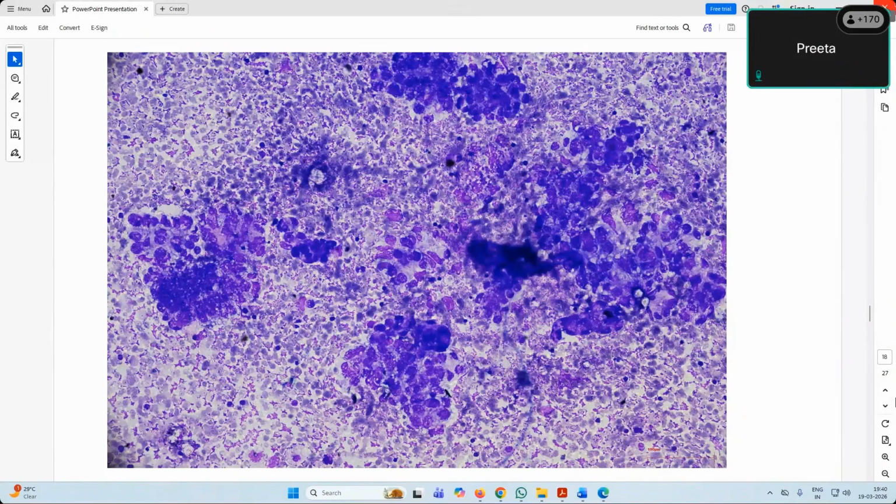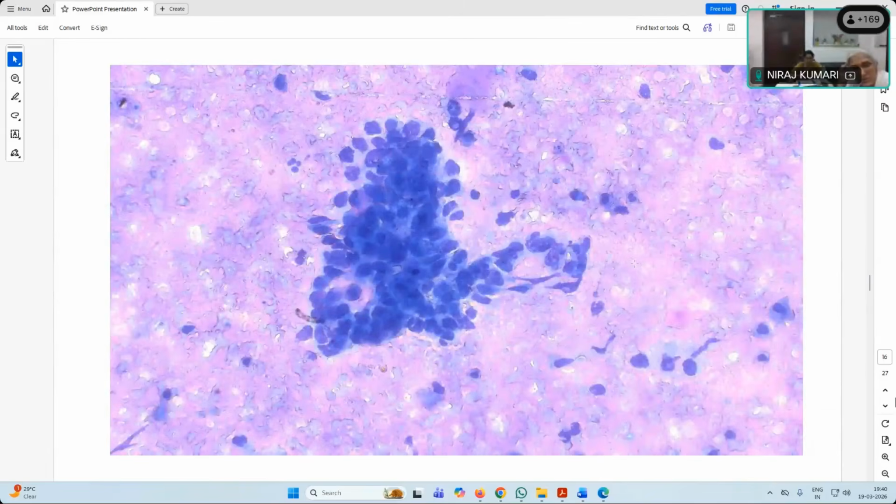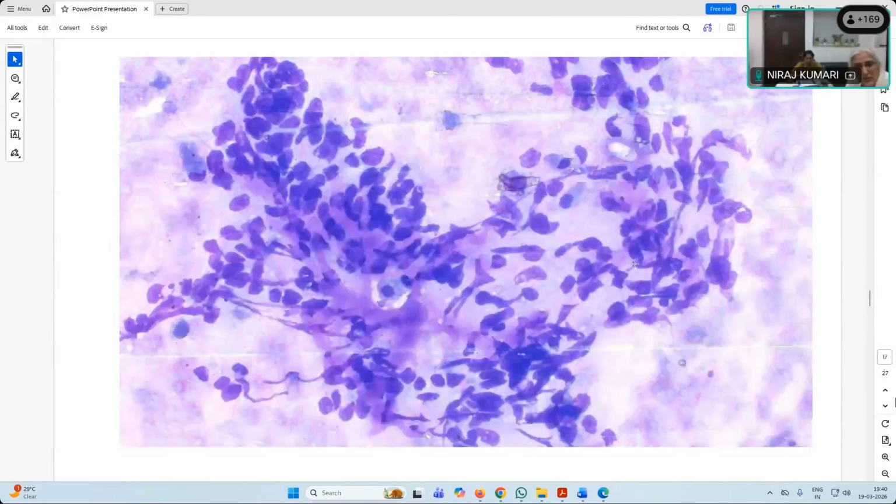Okay. So by seeing the morphology with the clinical correlation, with the clinical history that you just got, now what is your DD? Hepatoblastoma. Do you see these cells are hepatoid? Do they have the cytoplasm in hepatoblastoma? There are different types of hepatoblastoma. Usually it is very well differentiated hepatoid, looks polygonal, and you will see some cytoplasm. Here, do you see cells like that? And then the background, it is giving you some kind of granular gelatinous background, no?